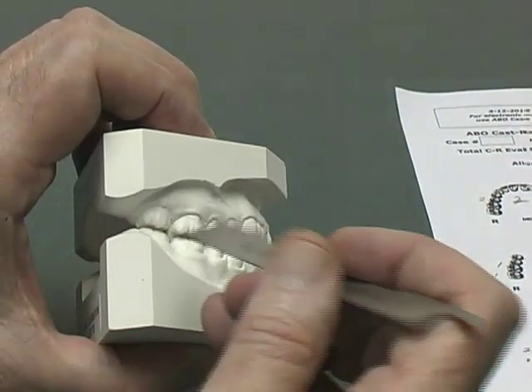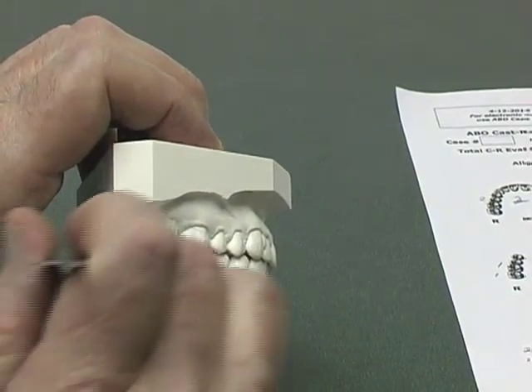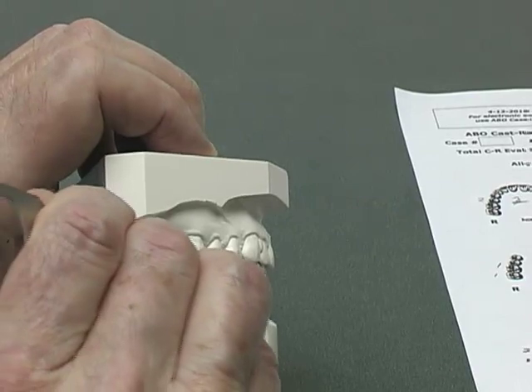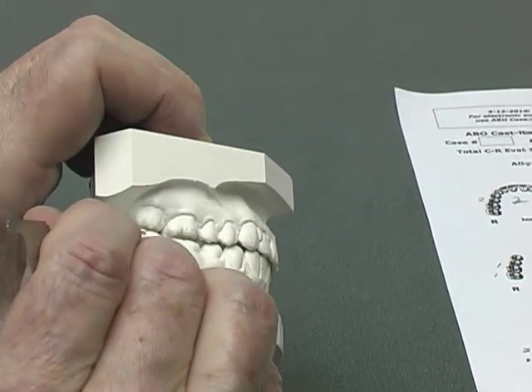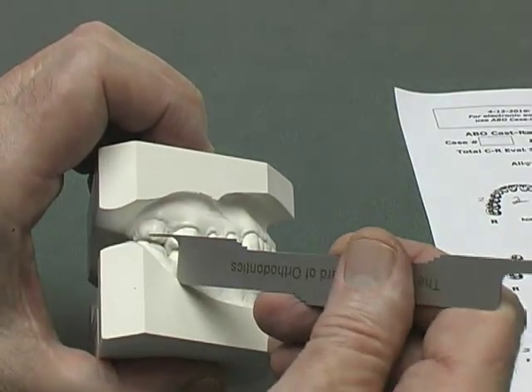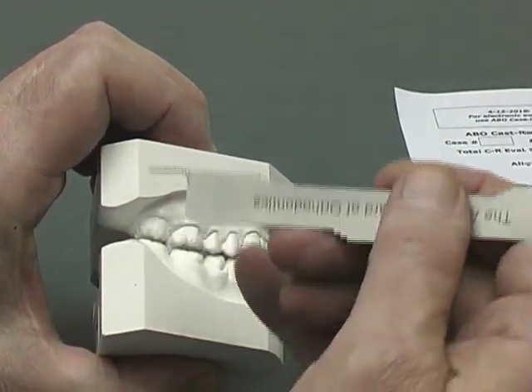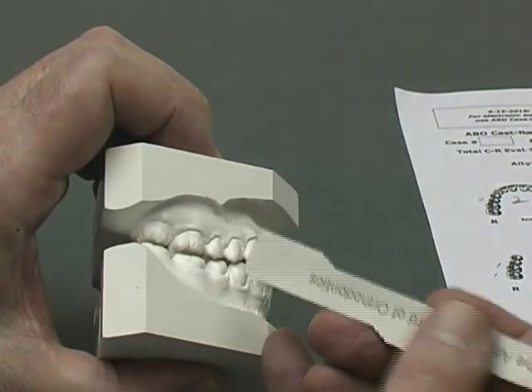I try the gauge from different angles — if I can get in with a half millimeter reading, I will turn it sideways to see if the one millimeter side will go in. In this case, the one millimeter side won't go in. So it's only a half millimeter opening, and the score will be one point for that half millimeter gap.